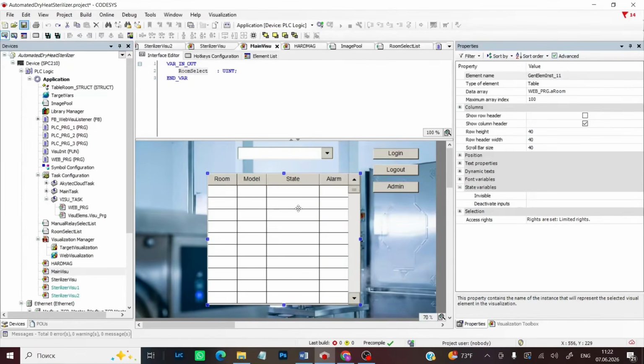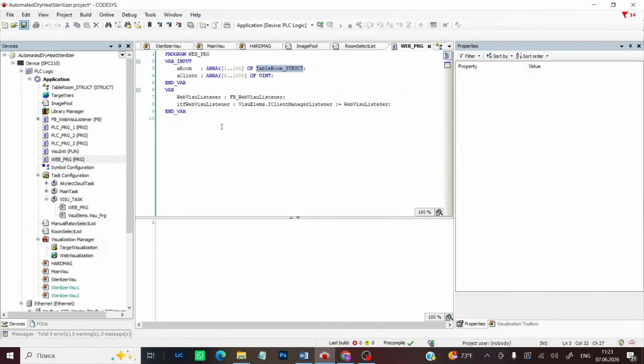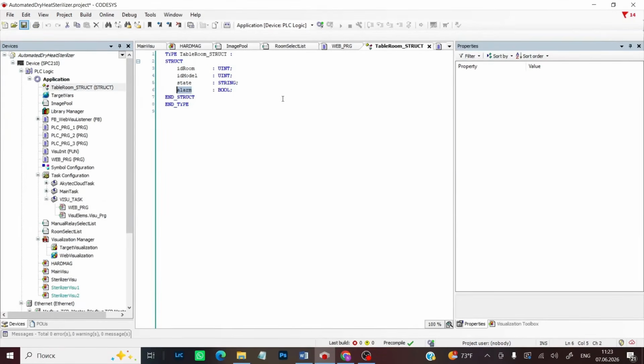Next, I created a table that will display the unique room number, the sterilizer model number in that room, the operating status of the sterilizer, and the alarm. For the data array field, I linked an array of 100 variables from the web_prg program, which I also added to the project, and I assigned this program to the VisuTask task. The variable type in this array is a structure, which I also added to the project, and in it I created fields to display the data in the table as listed above.